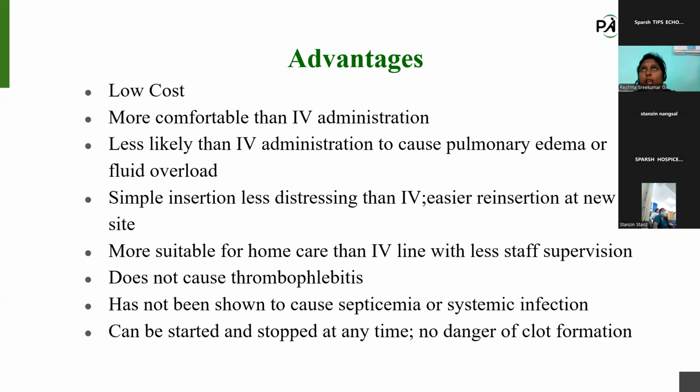If we are putting in an IV cannula, it is very important to maintain that cannula without any clot formation. Otherwise, the patient may feel pain while we are giving medication. There is no chance of clot formation in subcutaneous infusion, so we can easily give medications to that patient. And these are some of the advantages.